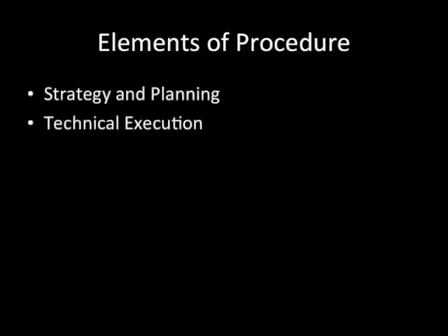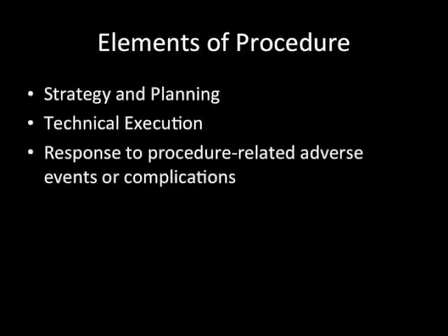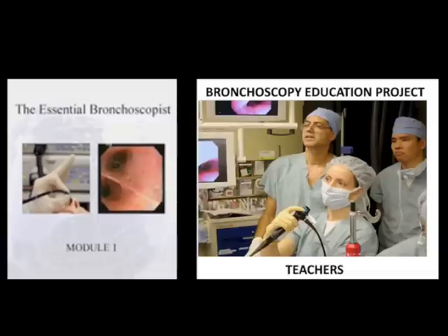To be a proficient and competent bronchoscopist, one must always consider the three major elements of a procedure: strategy and planning, technical execution, and response to procedure-related adverse events or complications.